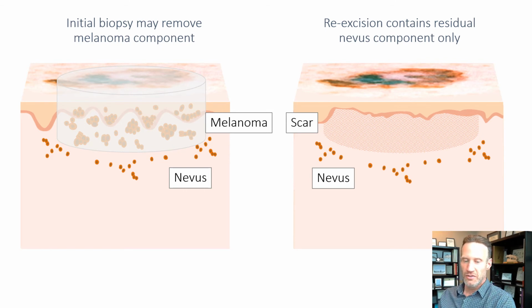In any event, lesions such as recurrent persistent nevi, traumatized nevi, locally recurrent melanomas, sclerosing variants of nevi and melanoma were all well represented within the myPath Melanoma validation cohorts. Hundreds of examples of these types of lesions have been among the 35,000 or so cases that have been tested in the clinical setting. So the bottom line is that to the extent that the lesion is well represented within the specimen that's submitted for testing, there's no evidence that accuracy of the myPath test suffers in this setting.